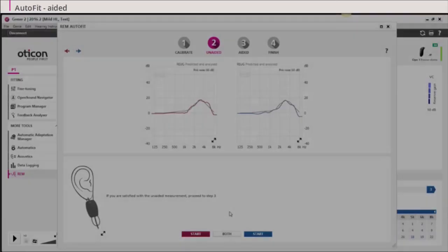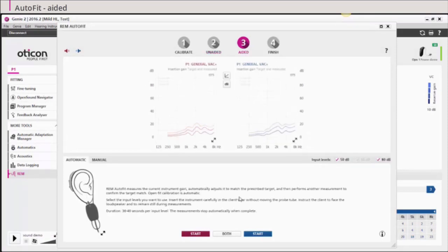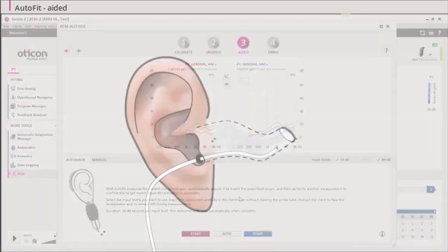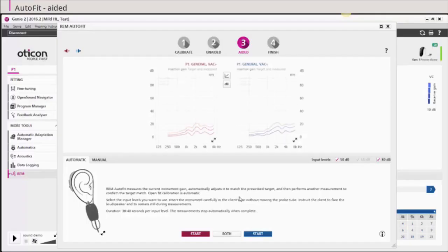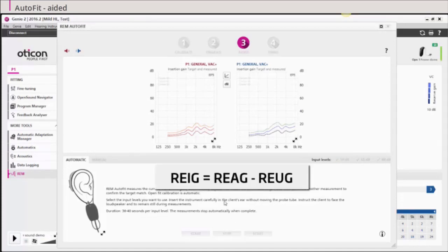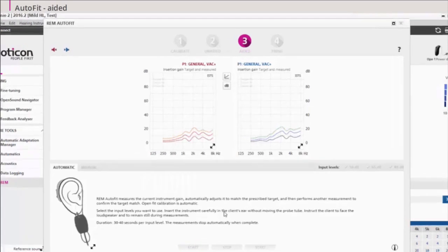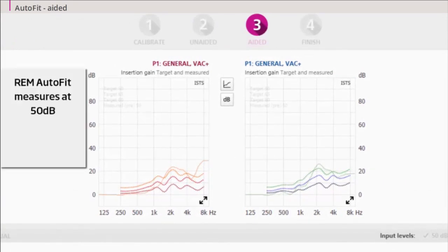To continue to real ear aided gain or REAG for short, click 3 Aided. Insert the hearing aids into the client's ear without displacing the probe tube. Press Start or both and the aided measurement will be performed. The insertion gain is now displayed on the graph. The REIG is a calculation of the unaided measurement subtracted from the aided measurement.